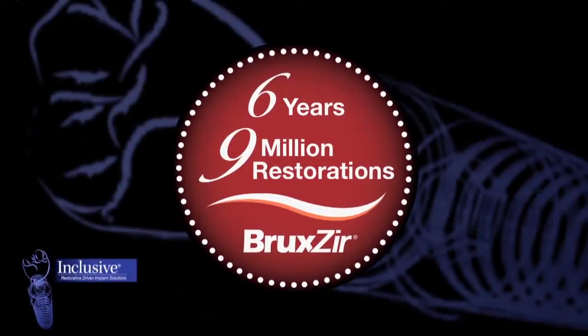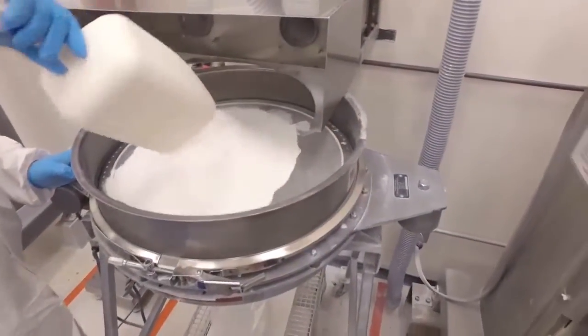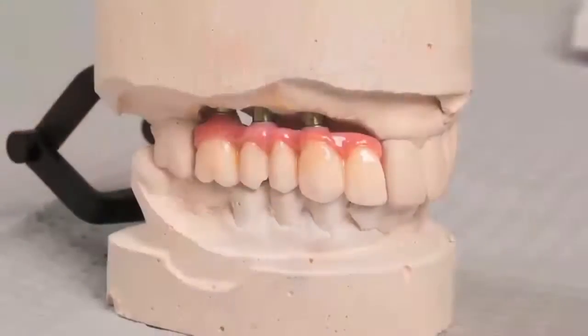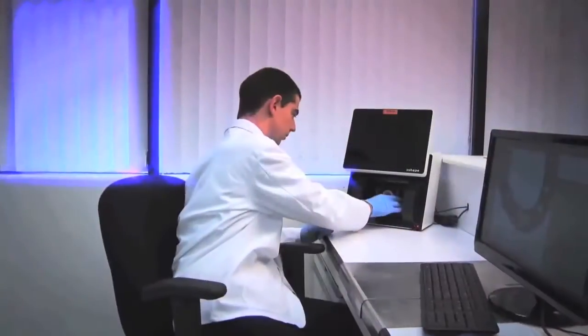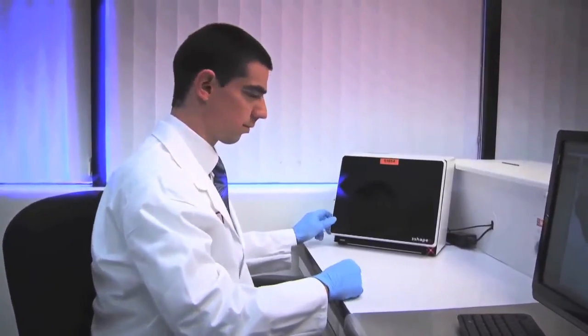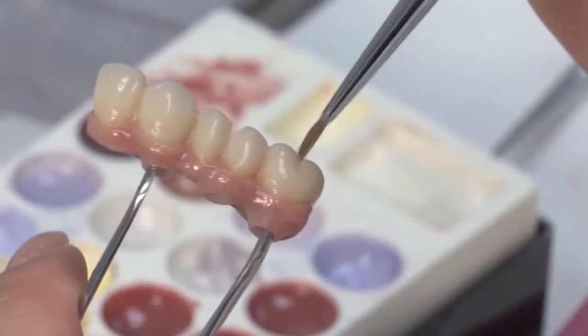With over 9 million units delivered, Bruxer Solid Zirconia is now available as an aesthetic, durable replacement for removable partial dentures. To create the Bruxer Partial Arch Implant Prosthesis, highly trained technicians utilize innovative CAD-CAM technology and exacting laboratory techniques to achieve a precise fit and an aesthetic final result.